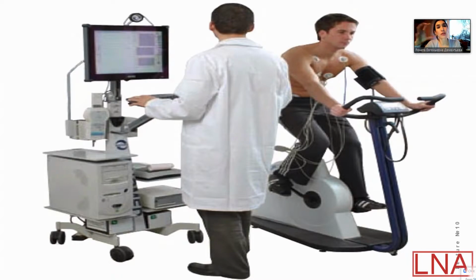Sure, first of all, for which pathology do we need this test? For coronary heart disease, yes, for finding some hidden types of occlusion of the coronary arteries. Look, electrodes, yes, for determining the ECG and measuring blood pressure simultaneously.